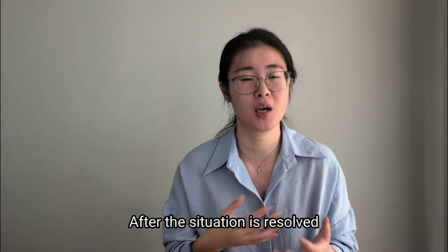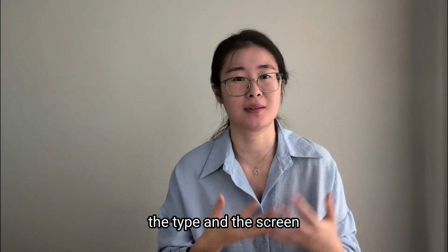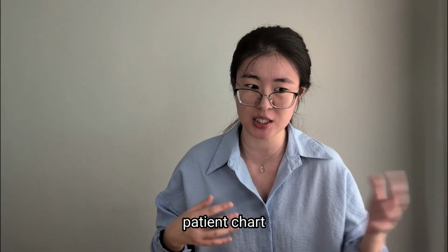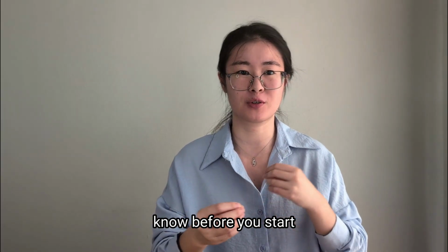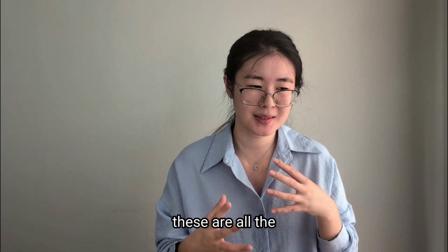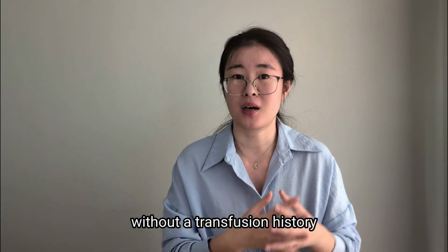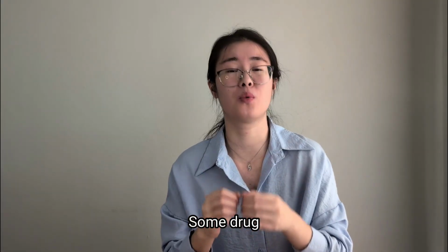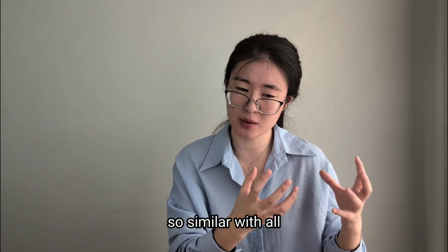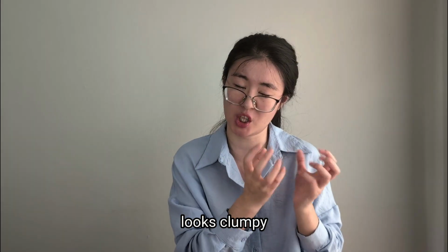After the situation is resolved, hopefully we can resume our normal workflow, which is giving you the type and screen. And you may ask, isn't that something that's supposed to be in the patient chart, so you should just know before you start the processing? Yes and no, because these are all things that can happen at any point in your life without a transfusion history. Some drugs will give you interference that is bad enough to look so similar to all the other conditions that I talked about. The patient's blood just looks clumpy.